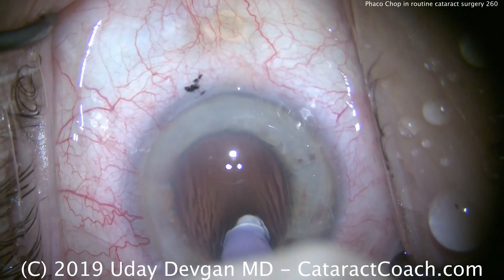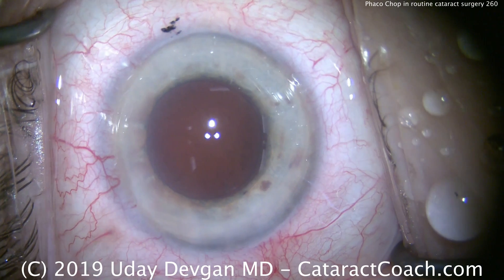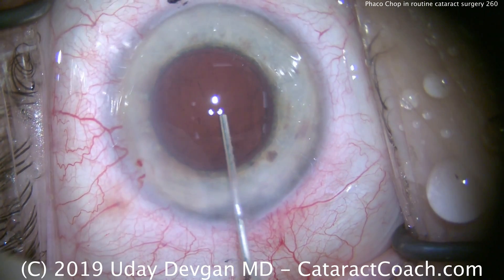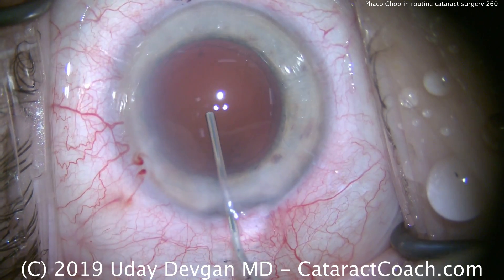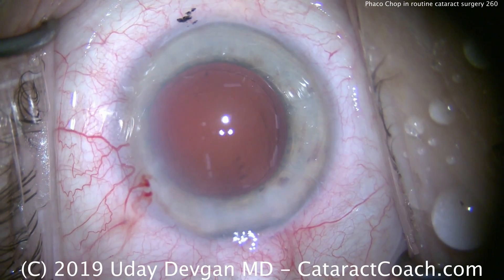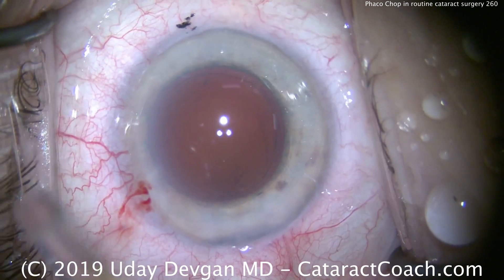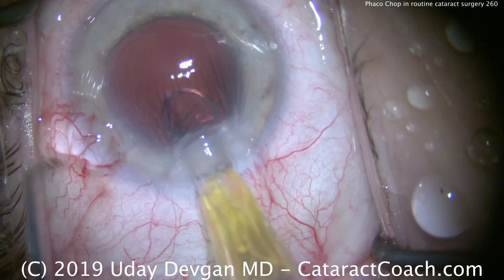We're going to put in a single-piece acrylic aspheric toric lens, and our technician is loading that up. Let's fill the capsular bag with cohesive viscoelastic — this will really inflate the bag. Once the IOL goes into the eye, we know the optic has a 6mm diameter, so you can judge the dilation and the rhexis size in relation to that 6mm diameter. In this case, we didn't have to do a lot of phaco chopping — in fact, there was just one primary chop, but that was sufficient.